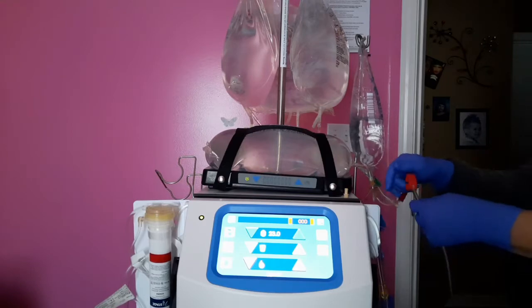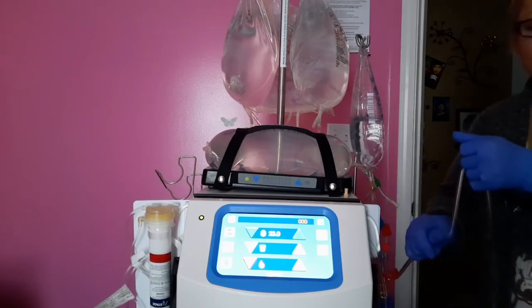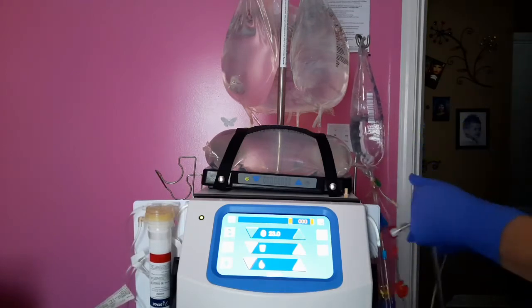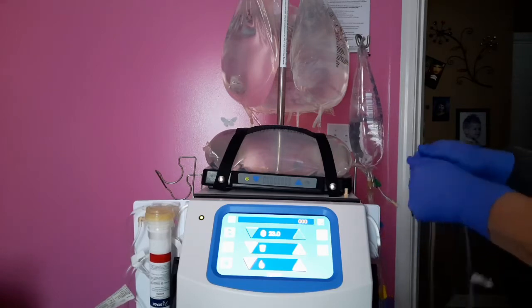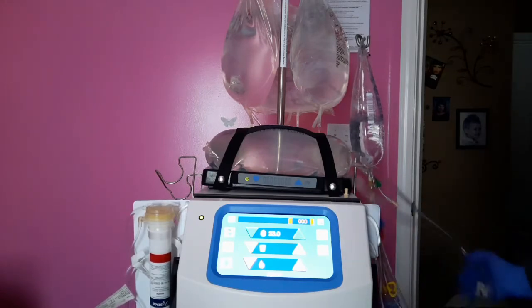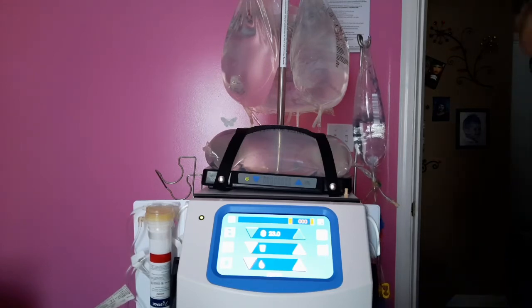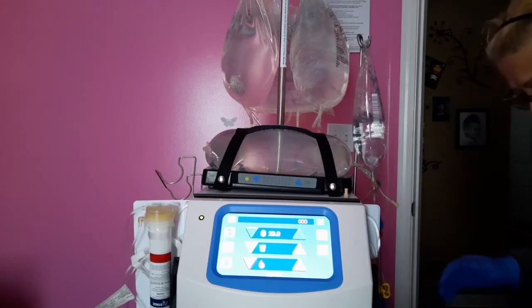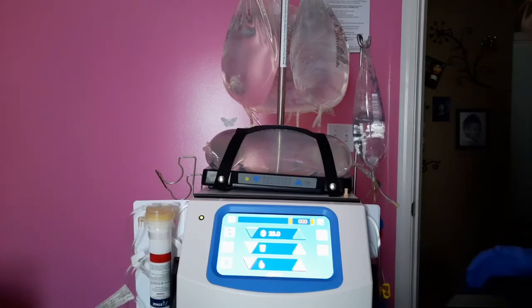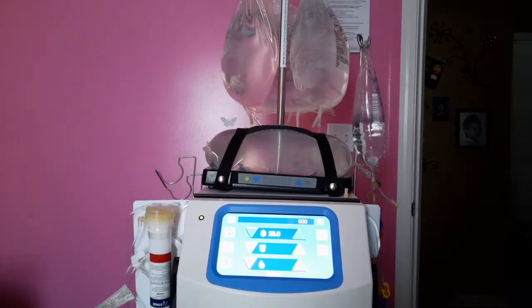So we're going to start at the saline bag, and in an L kind of shape, a fist apart. See? That's what we're going to do. And you do that all the way down to your pressure pump, which is the little disc. Has that membrane. And then you take it and you tap it, flip it back, tap it again, flip it back, tap it again, and we move on to the dialyzer on the left.